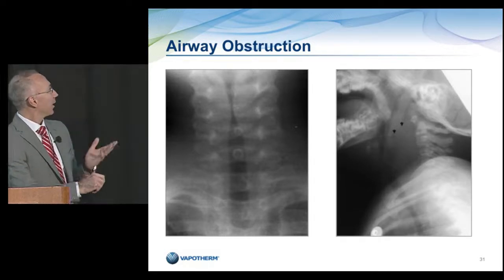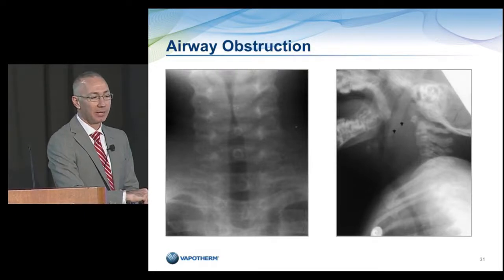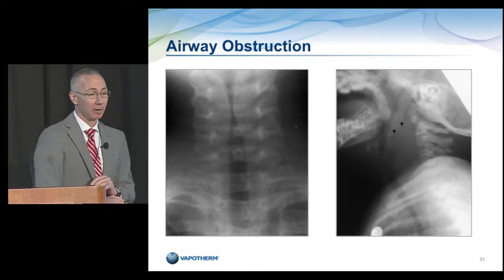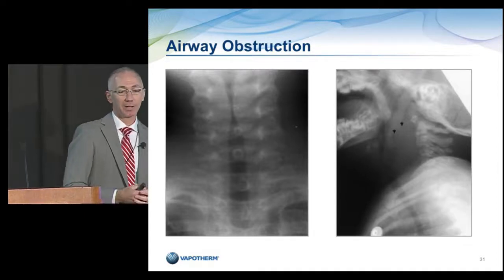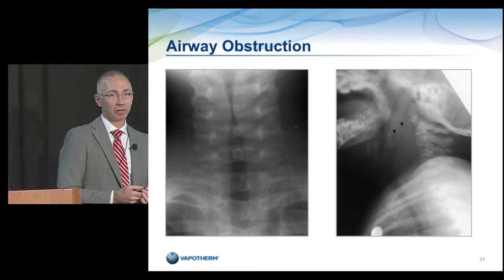This is an X-ray. I don't know if you can see the projection of a patient with a strong steeple sign. So this is a patient with croup and extrathoracic airway obstruction. It could have been a patient with post-extubation stridor as well. And this is a patient with retropharyngeal abscess. So these are patients with extrathoracic airway obstruction that have significant resistance to inspiratory flow.